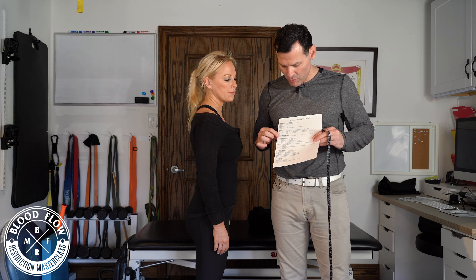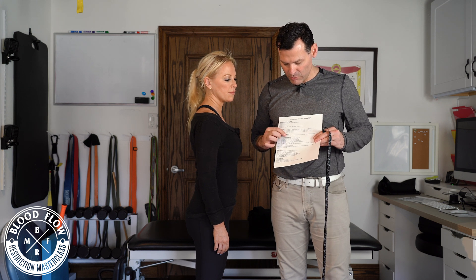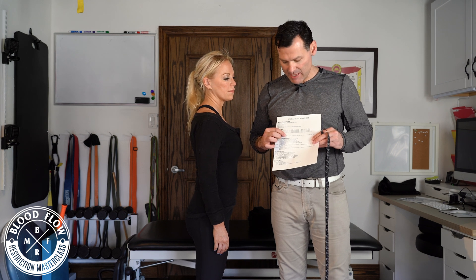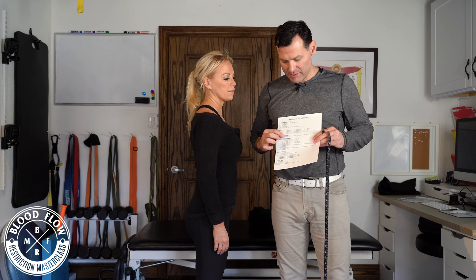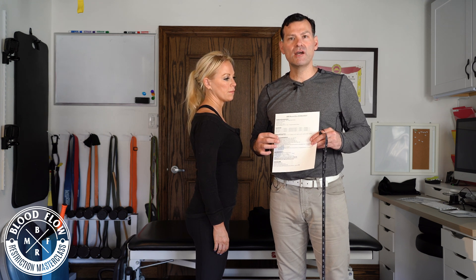The cuff size that correlates with that is limb size 6 to 11, which is cuff size number 1. You'll notice that 11 inches is included in cuff size 1, but it's also included in the lower end of cuff size 2. So we're normally going to use the smaller cuff as long as it fully encircles around the limb.